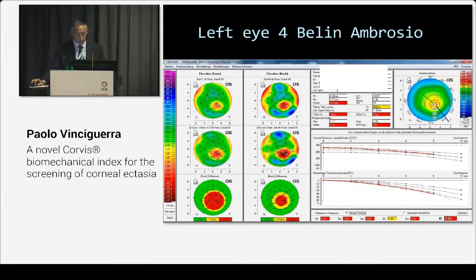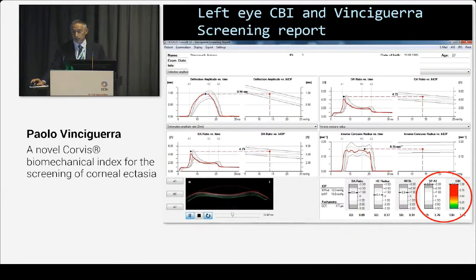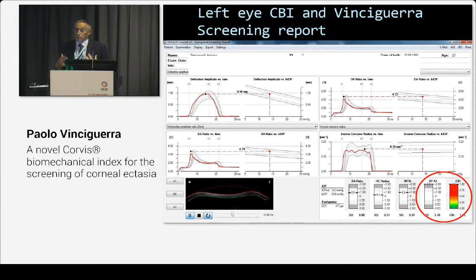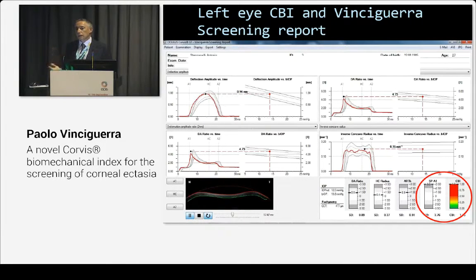Now it is easy — the Belin-Ambrósio analysis tells you it is risky and everything is out of range. But you want to know before. On the other hand, we have good news: we have risky patients where the Belin-Ambrósio index flags risk because, for example, I saw one last week — the patient had a very thick cornea, 625 microns, with normal endothelium, but the rate of pachymetric growth from center to periphery was abnormal because it starts from a very thick value. So in the index, it appeared as a steep cornea due to pachymetry, and many indexes — including the Klyce indexes — flagged it as risky. But the Corneal Biomechanical Index showed absolutely normal, making us much more confident in making clinical choices.